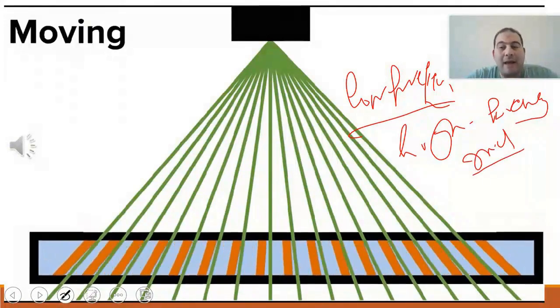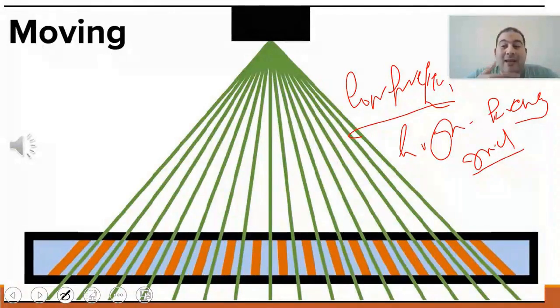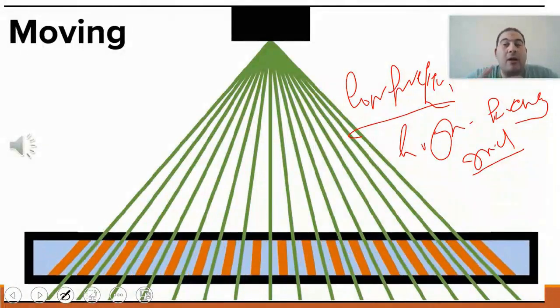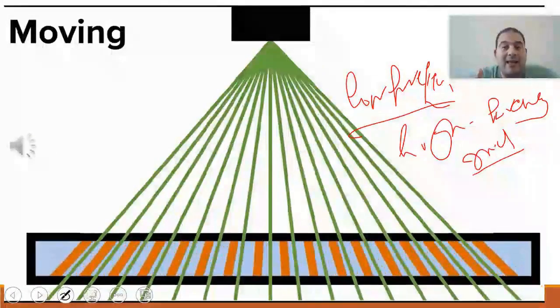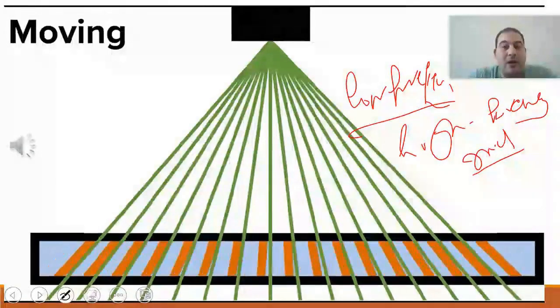And your grid is already at that point, your number of strips is very high. So why not use a high frequency grid to improve the resolution and significantly reduce the scatter? It will enhance the resolution and greatly decrease the scatter. Improving resolution is extremely essential, but keep in mind that this will come at the expense of your dose, which you will find will increase.